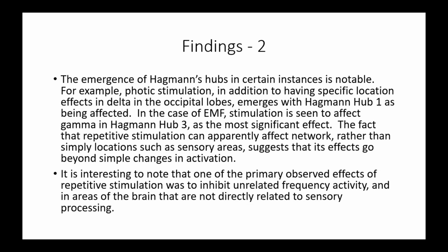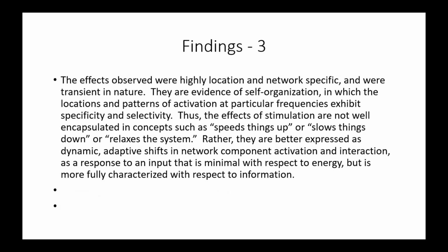hyperbaric oxygen. And one of the primary observed effects of the repetitive stimulation was to inhibit unrelated frequency activity in areas of the brain that are not related to sensory processing. So opened a lot of interesting doors, and we've learned a lot of interesting stuff. The effects observed were highly location and network specific. They were transient in nature.